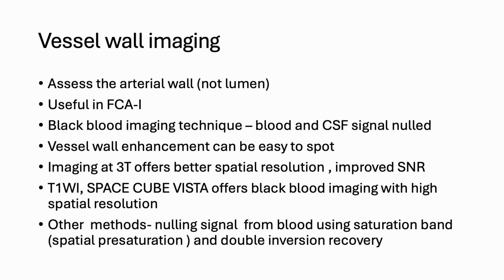So vessel wall imaging can be particularly useful in cases of vasculitis or focal cerebral arteriopathy, particularly of the inflammatory type, as most of the imaging modalities that we have at our avail only look at the lumen rather than the wall, and the wall can be involved in these etiologies.